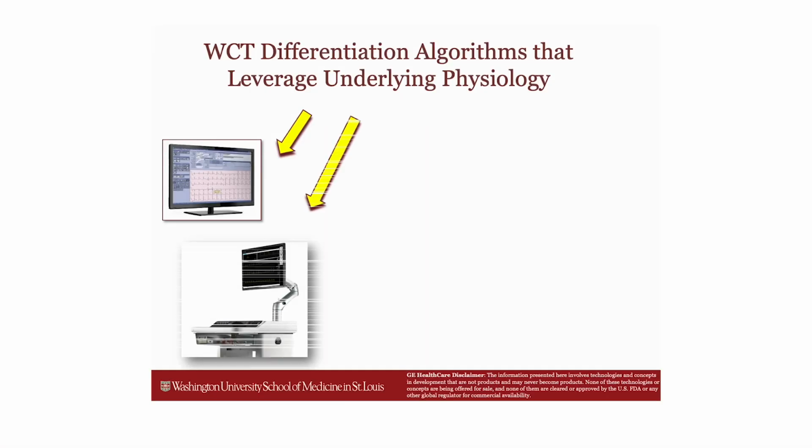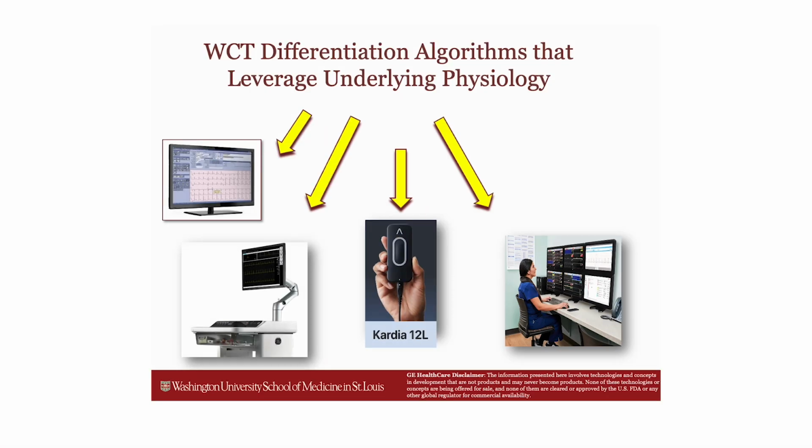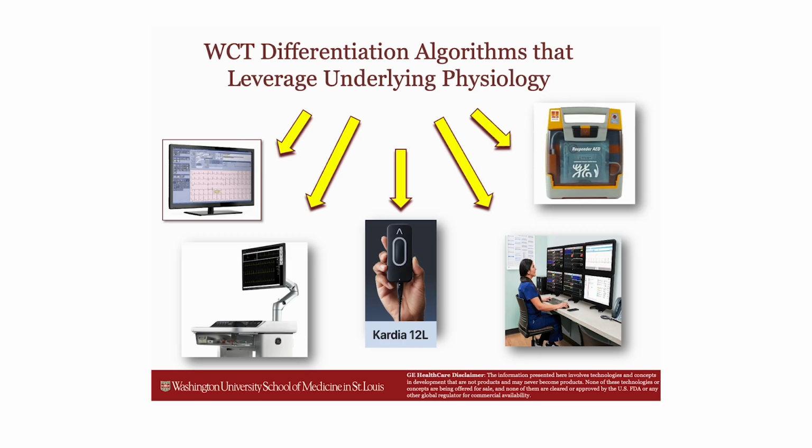And then thereafter, if that goes well, I think it's simply a question of how many people we wish to help with these algorithms. We certainly can put this into the 12SL software, but there's other opportunities in stress testing. There's also remote monitoring devices that could be utilized, and then also telemetry systems, that would be a big deal, and then also even AEDs. Now, the reason I think we could do that in a more immediate sense is because we're leveraging the ground truth or the underlying electrophysiologic basis to formulate these algorithms. So it's more transferable from one modality to the other.